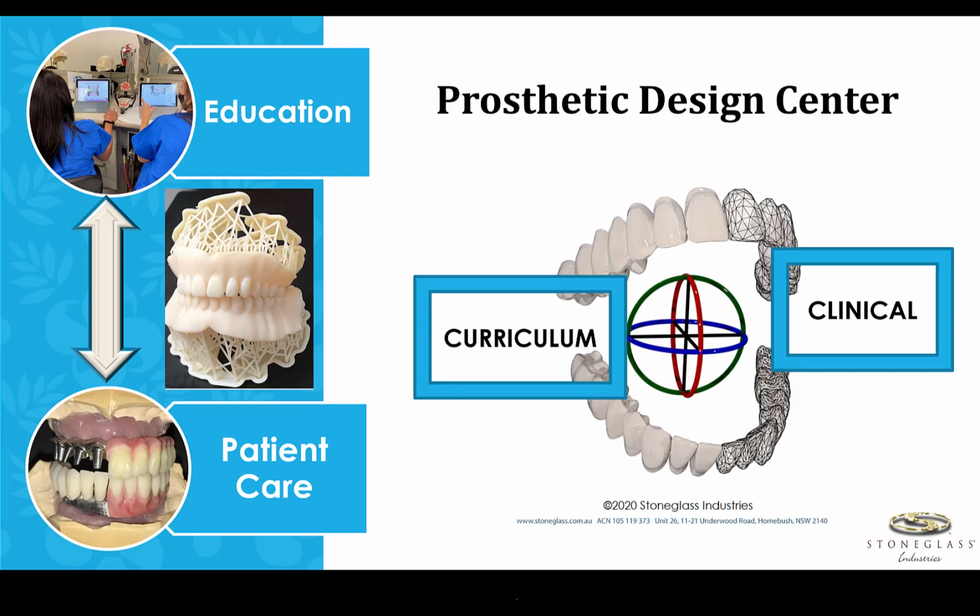Welcome to Stoneglass Industries and the Prosthetic Design Center software, otherwise known as PDC, a unique and innovative solution that comprehensively supports both clinical education and patient care in the realm of CAD/CAM digital technology. To summarize, what makes this software distinctly different from other systems is its versatility. There are three key arenas where this is demonstrated.